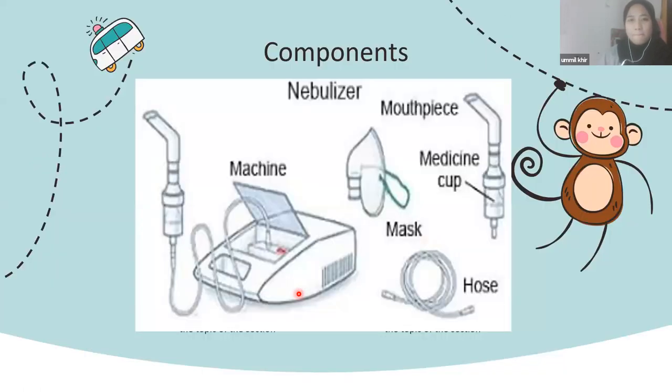Okay, next. So these are the components for this procedure for nebulization, which are, here we have the driving force, which is the machine, tubing hose, medicine cup, and mask and mouthpiece.